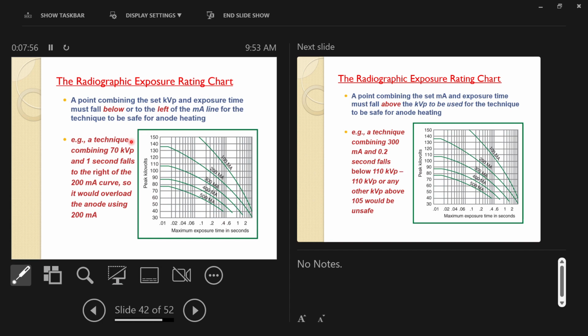So then that relates to the heat unit, because then they say this is the maximum. Yeah, behind the scenes there's a heat unit number being created here. And this is not showing you that number, this is using that number to tell us what our maximums are. Like you said, our machine is 4,000, and the heat unit produced was 3,300. So we can't go beyond that number because then you would exceed the 4,000 capacity.